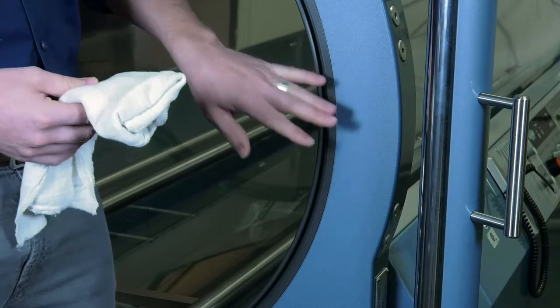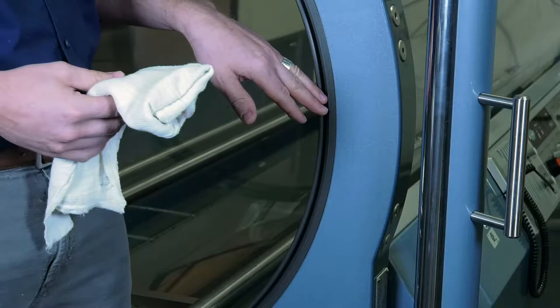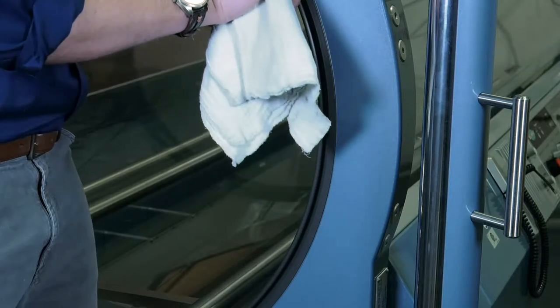The next step is to examine the groove that the door seal sits in. If you have any debris inside the groove, you want to clean it out with a clean rag. Just stick the rag inside the groove, run it all the way around, and clean out any debris.